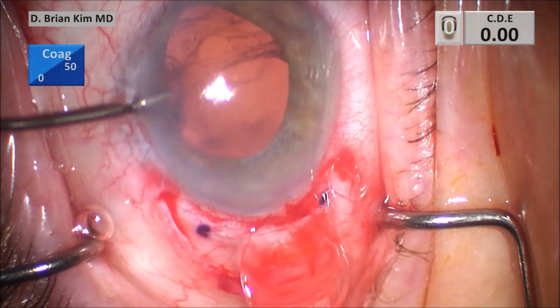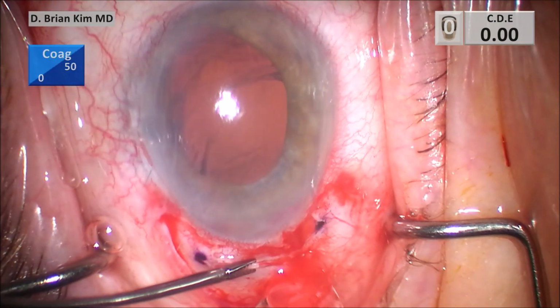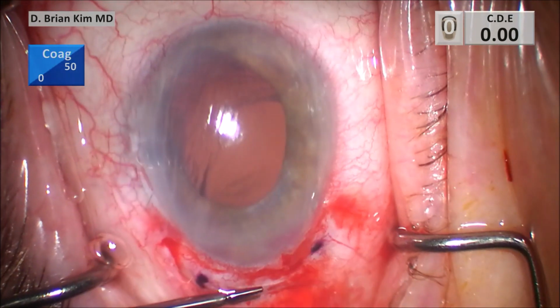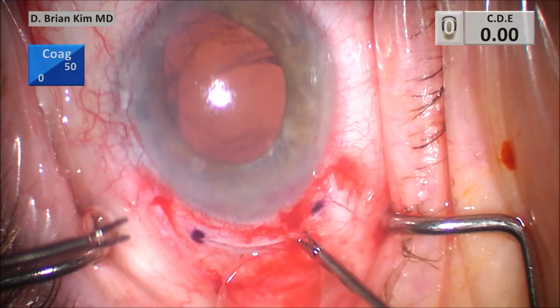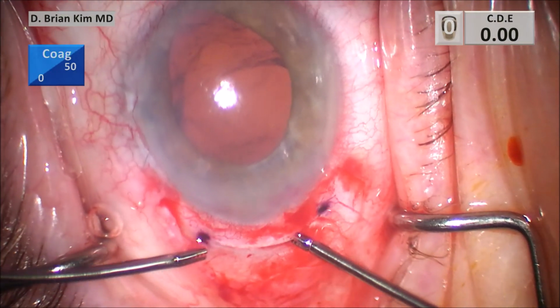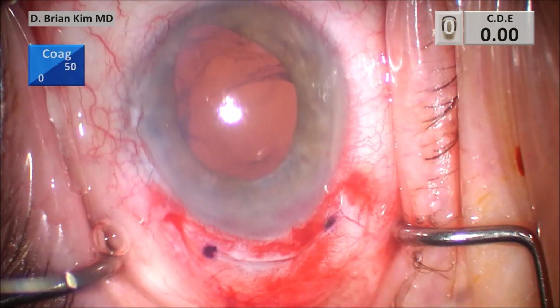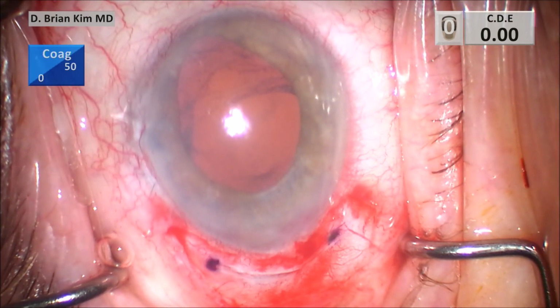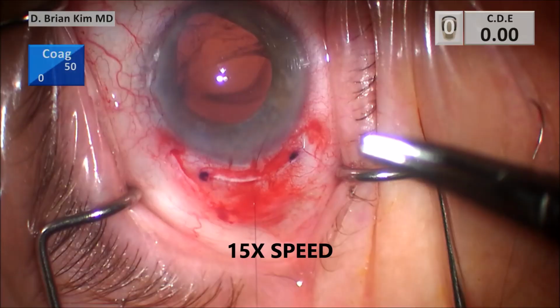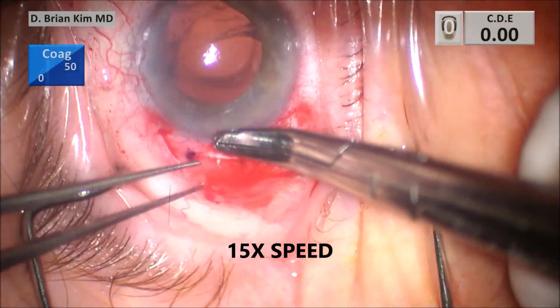And so you saw that maneuver. As I was pulling with the right hand, I made sure the forceps in the left hand was guarding the cornea. It's very important because as you're pulling it out, you're holding it with one hand at one point and you don't know what's going to happen as you pull out that lens. So protecting the corneal endothelium with the left hand is just an easy and smart thing to do when you're taking the lens out. And I go ahead and close the wound because I'm not going to use that wound for the Yamane.